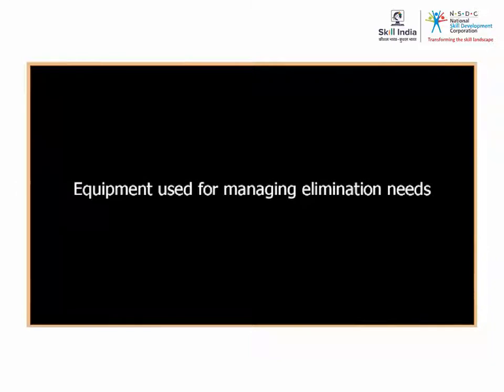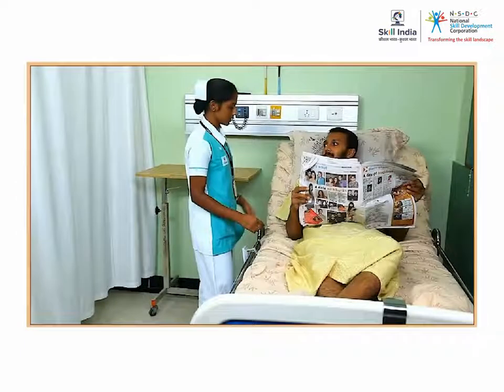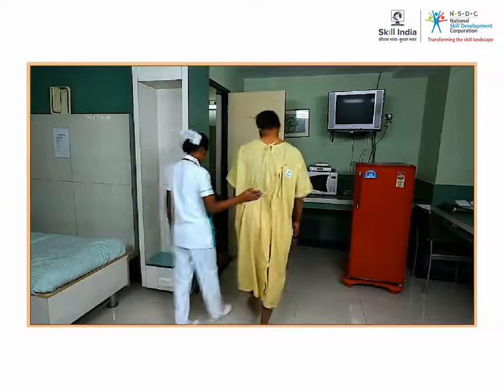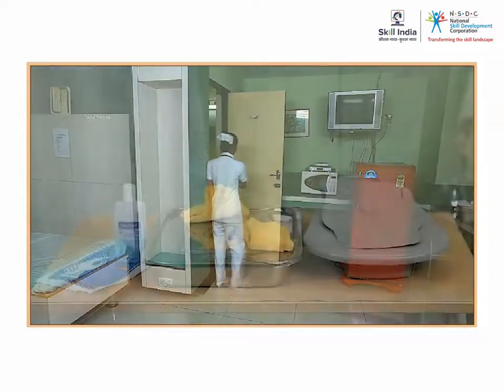Equipment used for managing elimination needs. Most patients who are in a good medical condition can express the need to use the toilet and manage their needs themselves. However, many of them might need some help to move to the toilet.